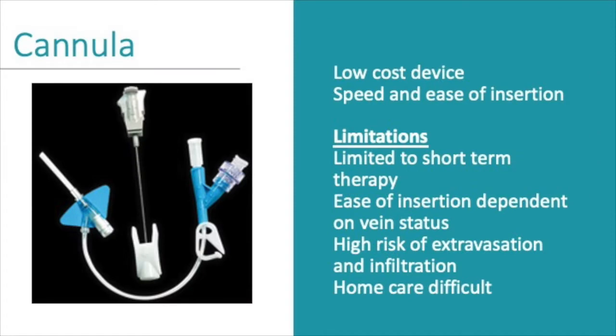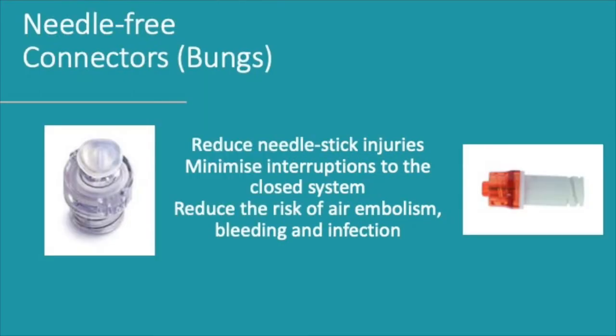Cannulas are often used, they are easy to put in. They are for short-term use. You can't take blood from them apart from the first time you put in the cannula. That's when you can take the blood. After that, you cannot take blood from it. They can be quite fragile in the sense that you can only put certain medications through it. They can't go home.